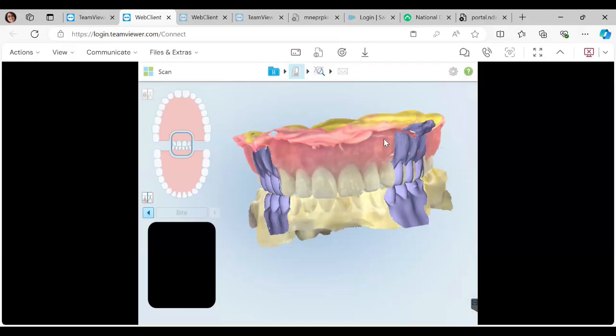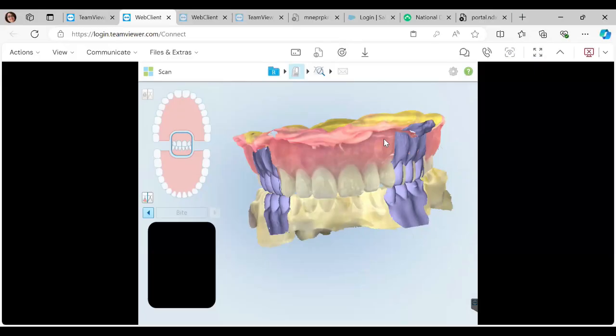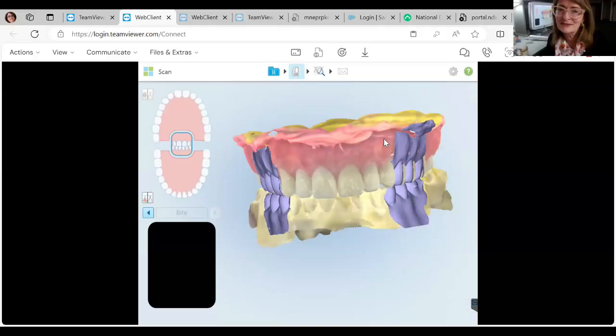Then can a printed denture be realigned with a chairside reline material? Yes, it can. I should say ours can. We use Dentsply Lucitone Print material for our premium printed dentures. And I know that you can use CoSoft chairside reline material with that for sure. Great. Thank you. Of course. That's all that's popping up right now.